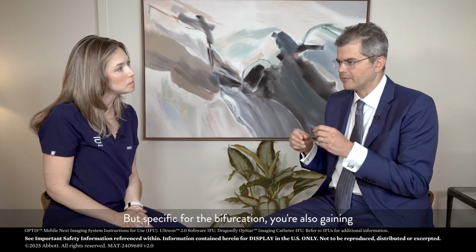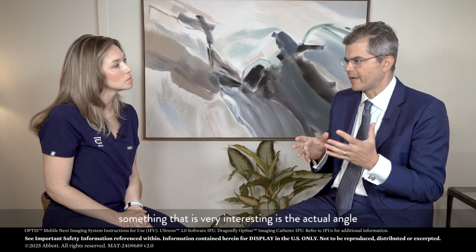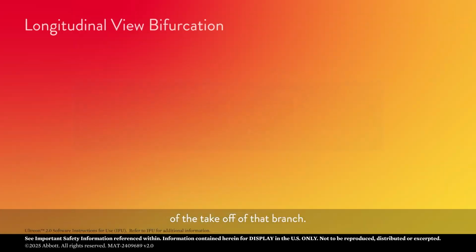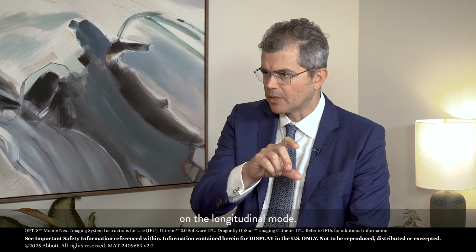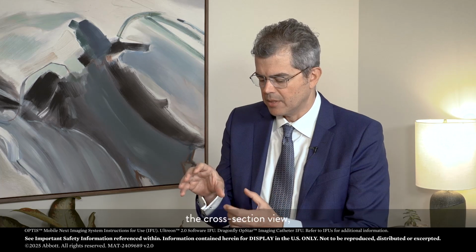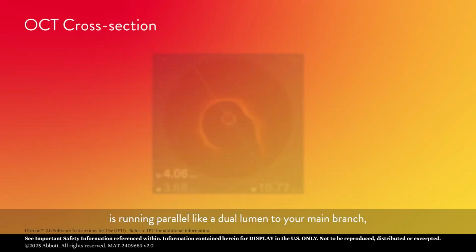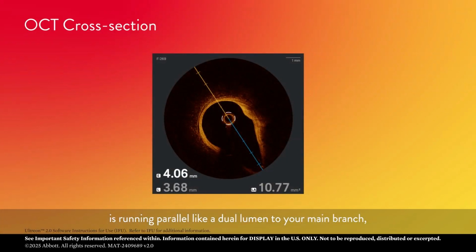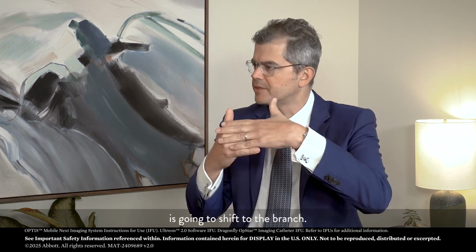But specific for the bifurcation, you also gain something very interesting, which is the actual angle of the takeoff of that branch. You can see this on the longitudinal mode. You can also follow the cross-section view, and if your side branch is running parallel, like a dual lumen to your main branch, you would anticipate that some of this carina is going to shift to the branch.